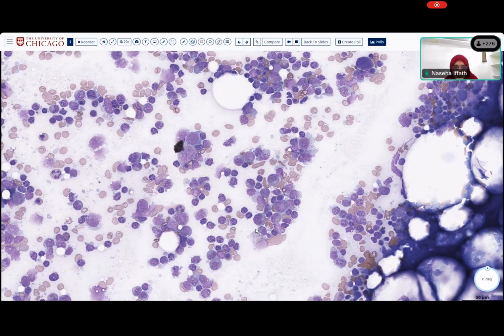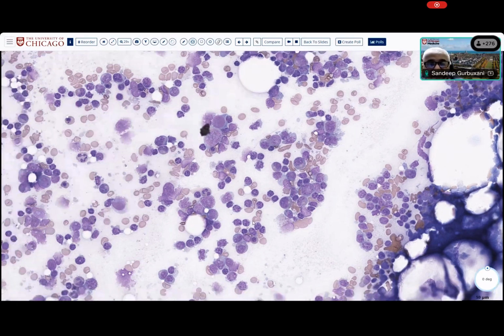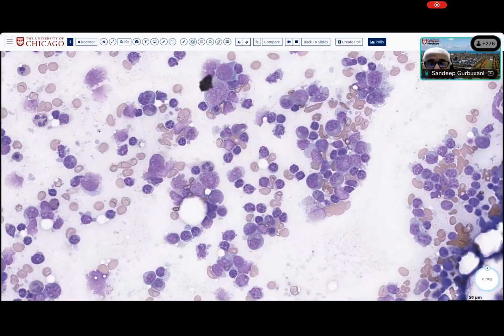So, erythroid lineage cells are there, sir. Okay. So, all right, let's focus on this area here for a minute and see what we can do about the lineage. So what do you think this cell is? Intermediate normoblast, sir. Intermediate normoblast or an erythroid precursor, right? So do these cells look similar or are they different from the cell? They are different, sir. They're different, right? So do we want to revisit the lineage? Sure. Lymphoid or myeloid? Let's start there.